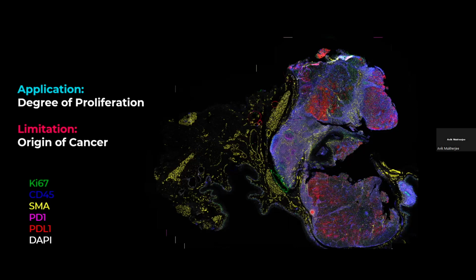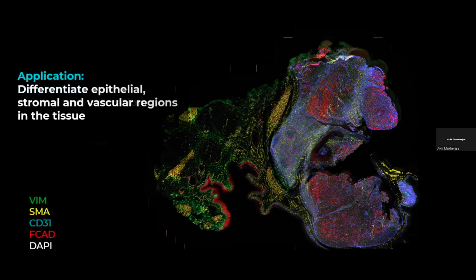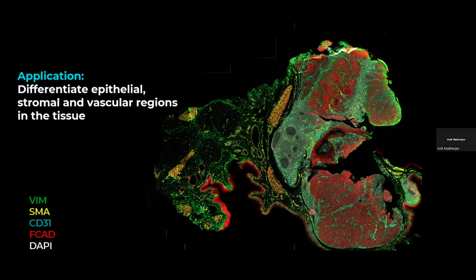So basically, I'm trying to show you we're looking at the same piece of tissue, adding more. Now you look at the structural data, vimentin, SMA1. You can see CD31. It looks like a highway through the tumor. And using this panel, it's telling us that an ultimate understanding of the tumor microenvironment can be achieved. Now you can see there are 4 tumor regions.